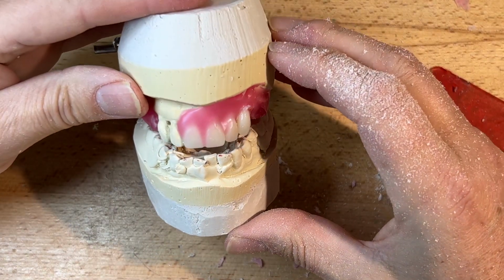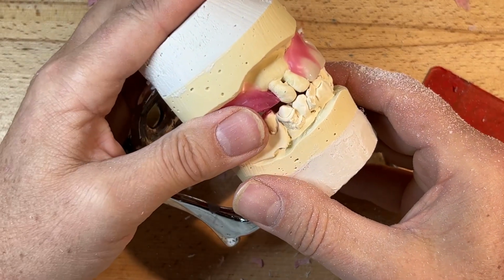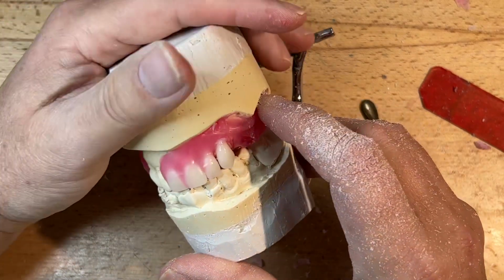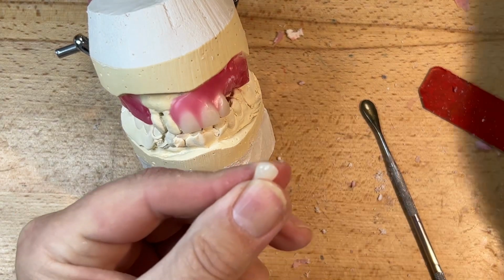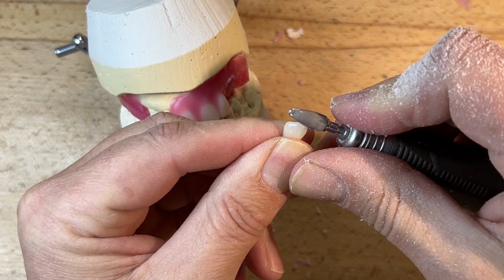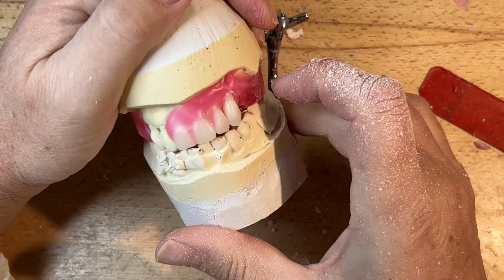Now this canine obviously has some wear on the incisal edge, as most people do when they're aging, and if we go to lateral excursion, you can see this relationship between the upper 1-3 and the lower 4-3. And maybe we can kind of simulate that on the other side by taking, denture teeth are created for partials and flippers and all kinds of relations. They're made for us to customize if we wish. I mean, they're very youthful, and most of the clients are not at that stage.